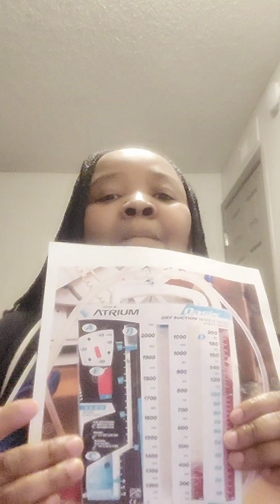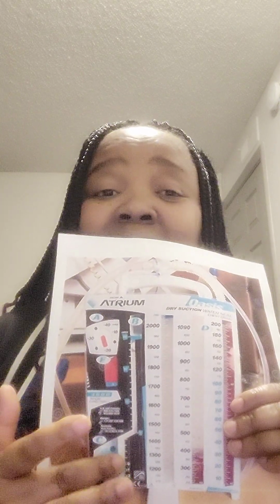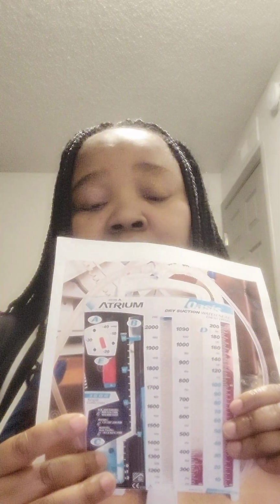So take note of those important differences. But generally, what you should see here that counts as normal is gentle bubbling in the water seal, until the time that the lung re-expands.